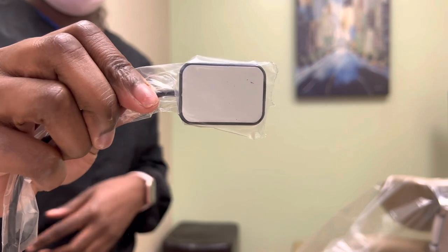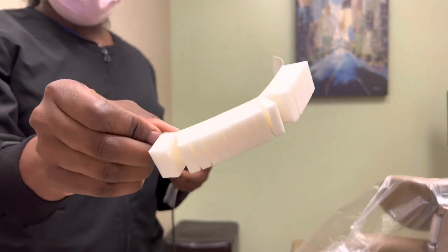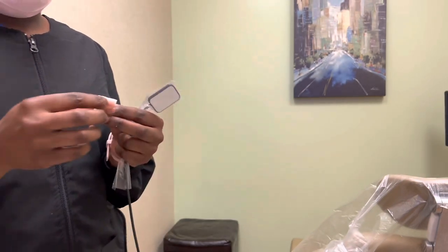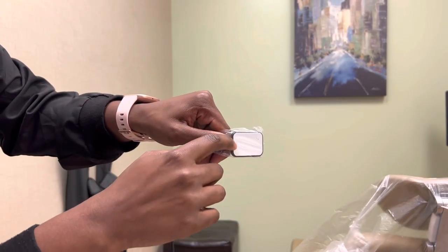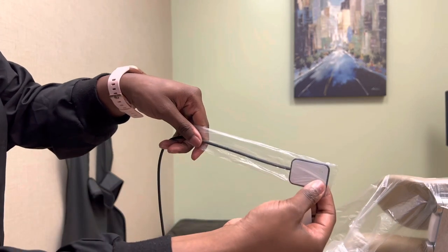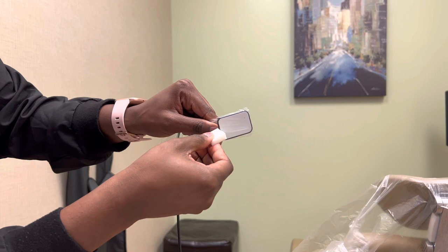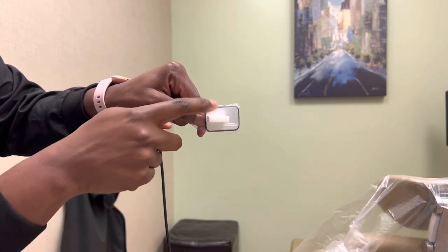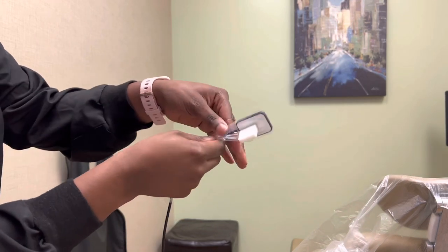I'm going to be using the size two digital x-ray sensor. You can also use this method with a size one sensor for kids — it's actually highly recommended for kids because it just makes it easier. I use these spongy tabs, but if your office has paper tabs you can do the same method with those. I take my spongy tab and stick it right on the very edge of the sensor. Always make sure you put the tab on the side where the cord is, because as you take the x-ray the cord always exits the mouth — never toward the throat. You should have equal distribution for biting, and look how small that is — much more comfortable than the hard piece for the XCP ring.